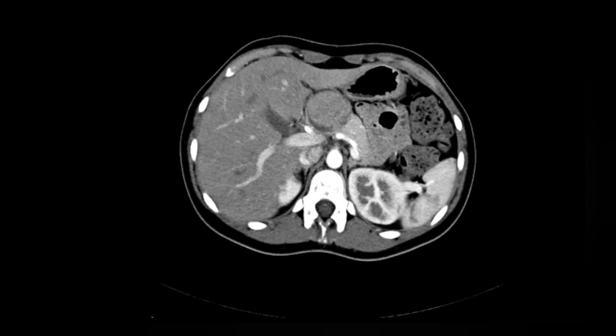No. So neuroendocrine tumor. Sir, they will enhance more avidly. Yes. So for neuroendocrine tumor, we have the hypervascular typical neuroendocrine tumor, we have atypical neuroendocrine tumor, we have functioning or non-functioning neuroendocrine tumor.